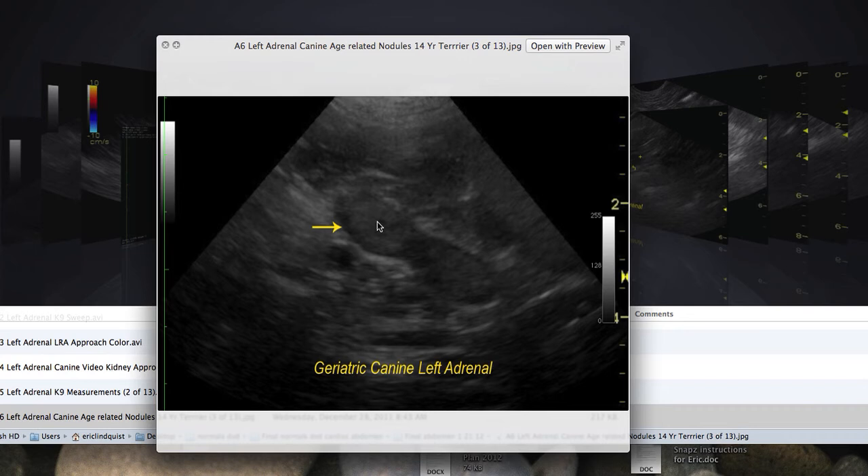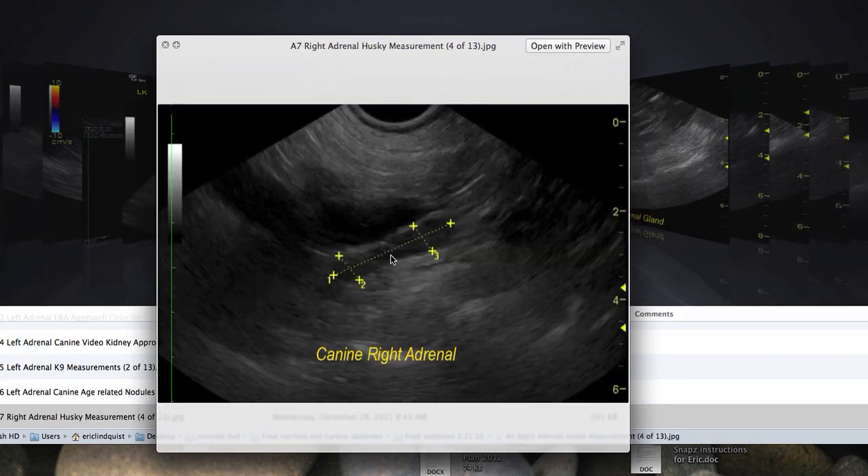These nodules can also be adenomas — benign tumors. You can see there's no capsular expansion, the capsule is maintained, the integrity of the gland is maintained, and there's no peripheral hyperechoic inflammatory pattern. The capsule is not stretched, and even though we lose the corticomedullary definition, the structure is largely maintained. This is a common finding that we never used to see because we never used to scan adrenals this well. Scanning at two to three centimeters, we can see that kind of detail even with a $40,000 machine.